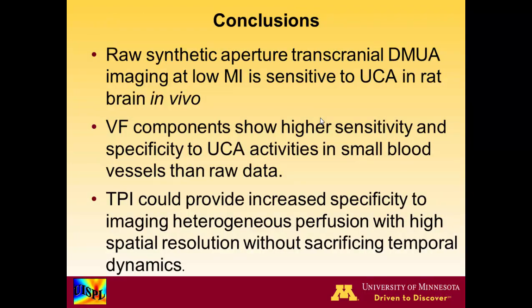In conclusion, we show that low mechanical index synthetic aperture transcranial DMUA imaging is sensitive to the contrast activity in the rat brain in vivo. The Volterra filter components show higher sensitivity and specificity than the raw data. And TPI is able to provide increased specificity to image the heterogeneous perfusion with high spatial resolution without sacrificing temporal dynamics.